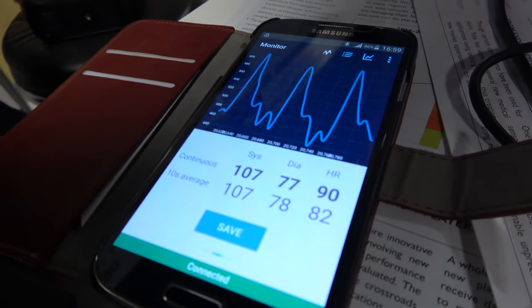What I'm doing here is taking blood pressure the way doctors normally would — keeping it at the phlebostatic axis, which is a technical term for keeping it at the level of the heart, so I get the best metric.